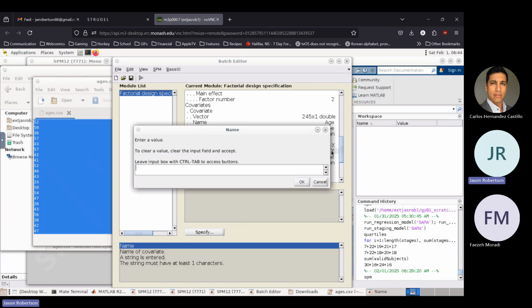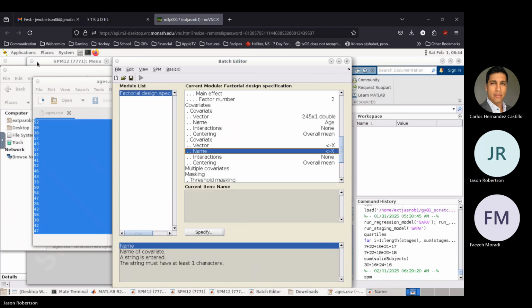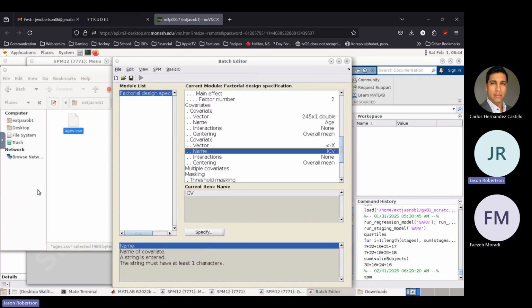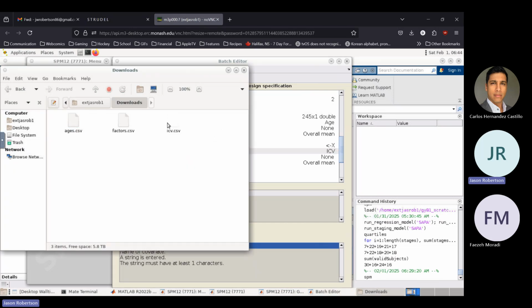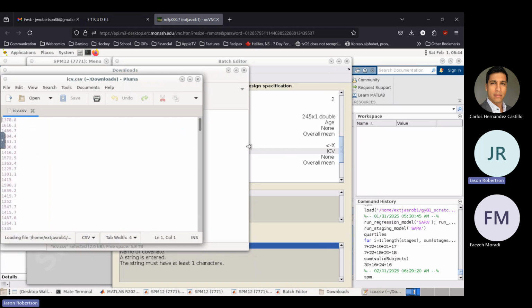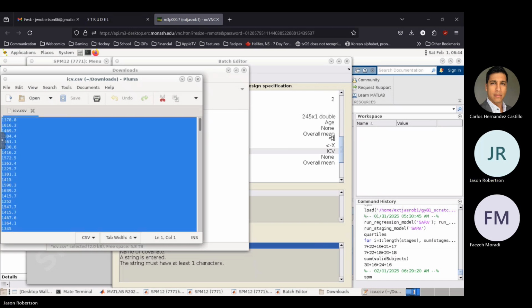The other covariate is intracranial volume. This accounts for head size, which is very important just in general for VBM, but specifically it also helps account for any sex differences, because men tend to have much larger skull cavities than women.